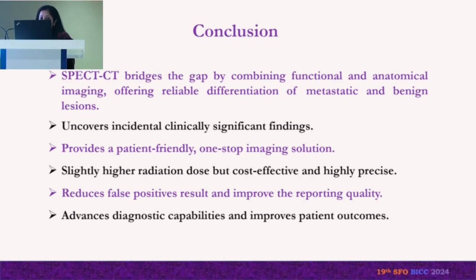In conclusion, SPECT CT bridges the gap by combining functional and anatomical imaging, offering reliable differentiation of metastatic and benign lesions, uncovers incidental clinically significant findings, and provides a patient-friendly one-stop imaging solution. Of course, slightly higher radiation dose, but cost-effective and highly precise. It reduces the false positive results and improves the reporting quality.